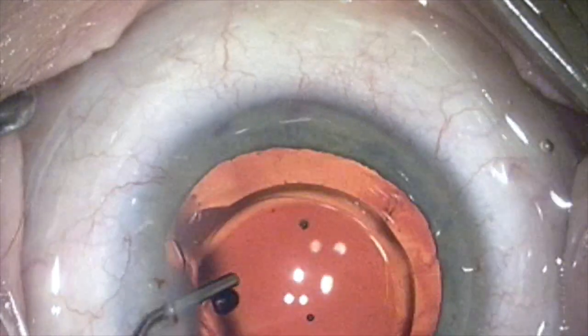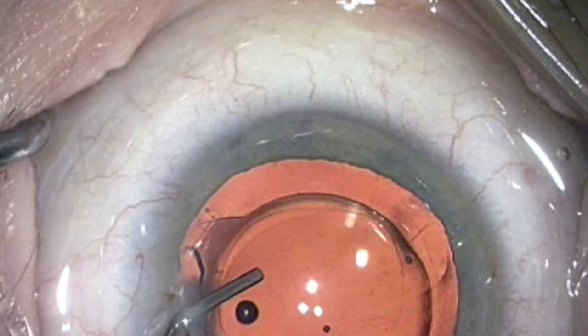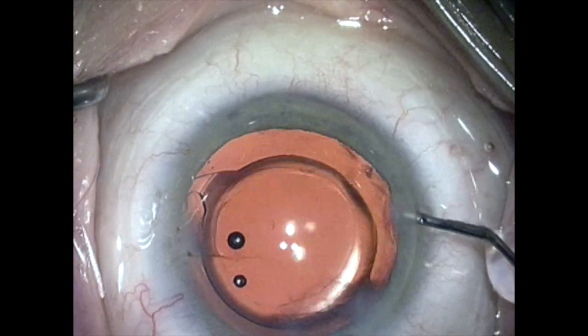Here's a second eye demonstrating the same phenomenon. This is a nice easy test that you can do with BSS after placing this stent.